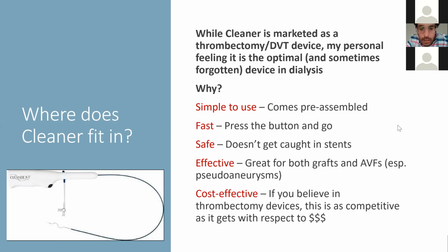Specifically, there's a lot of literature from Penn, and Dr. Trerotola has published a lot on this. And then the other thing that I would suggest to mention, we'll go into this, is the KDOQI guidelines for vascular access. It's a multidisciplinary working group that publishes guidelines on treating dialysis patients. So between those three resources, that's a lot of really high quality information that you can get.